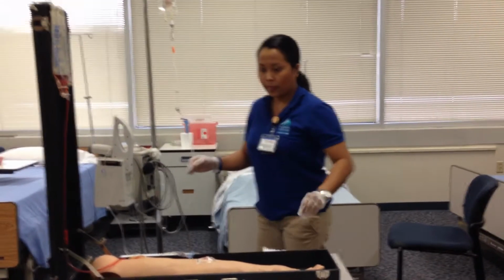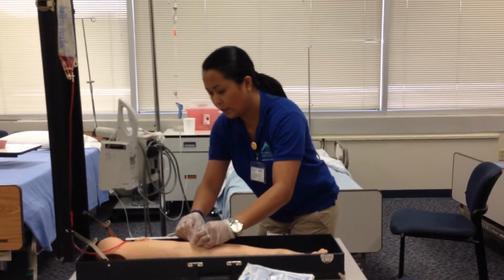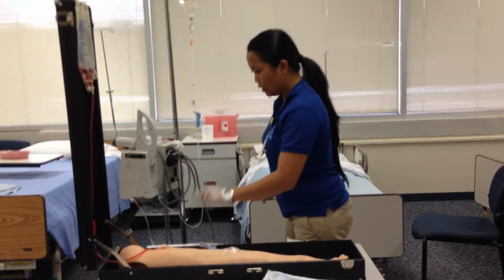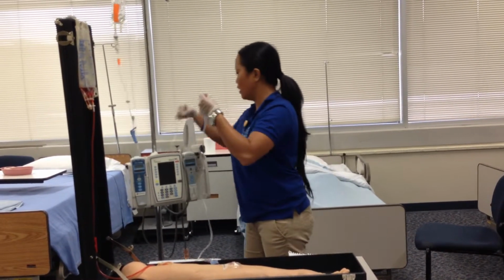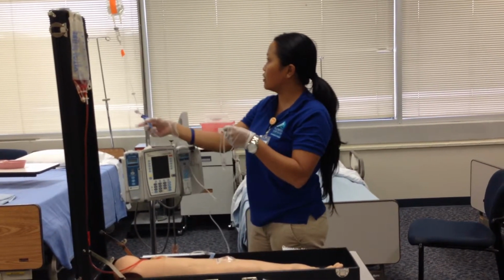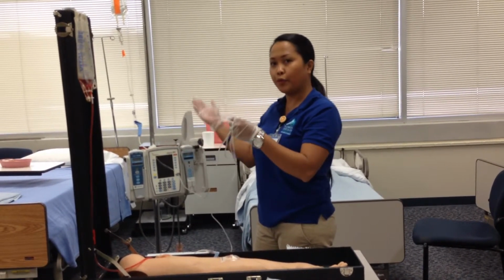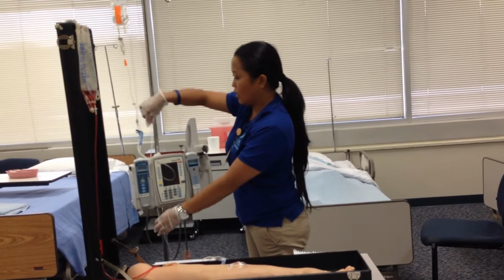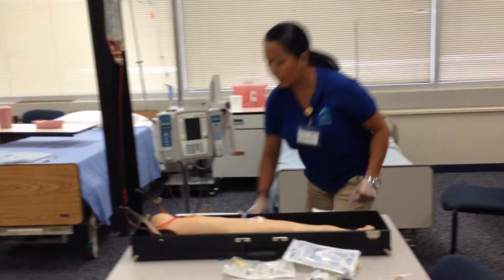And this is all good. And I'll make sure that the IV is unclamped. This is all good. The line is out, the line is right, the correct line. And I already re-established that it is 8 drops per minute, which is 4 drops per 30 seconds, and then 2 drops per 15 seconds. And I already counted that, and then I'll make sure there's no trouble with the line.